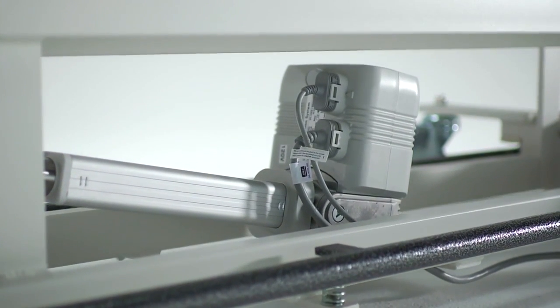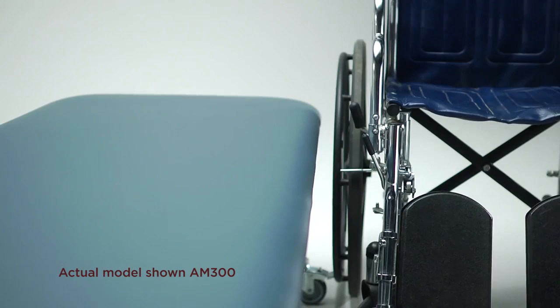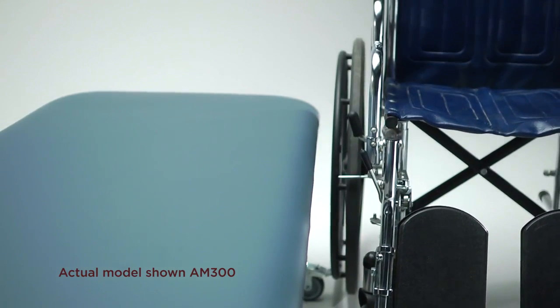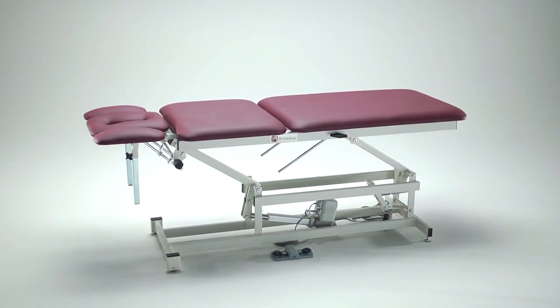This table has a capacity of 400 pounds. Like most of our tables, it lowers to 18 inches for easy patient transfer to and from standard wheelchairs or most other patient transport equipment. It elevates up to 37 inches and allows ideal interaction between clinician and patient.